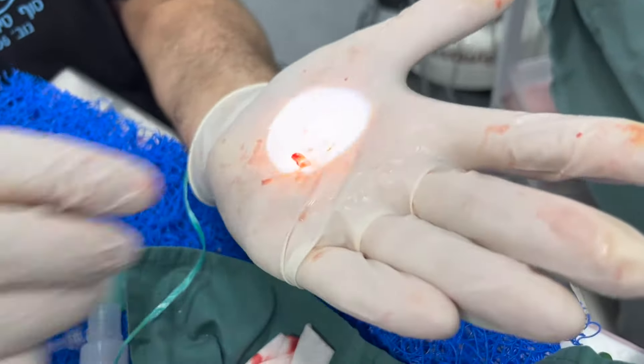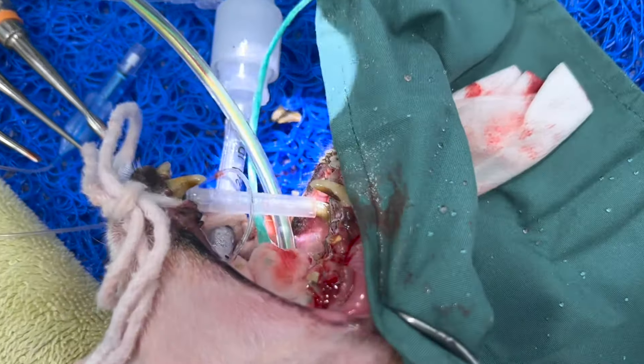That's the second root out. We'll take an X-ray to confirm the roots are completely removed, and now we'll work on the third one.